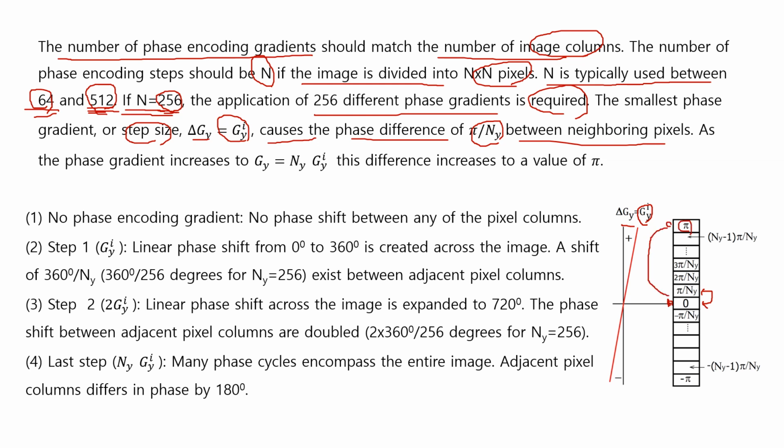The same thing here, just minus pi here. So the phase difference between the center and this edge is pi also.